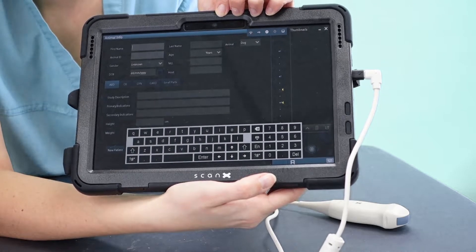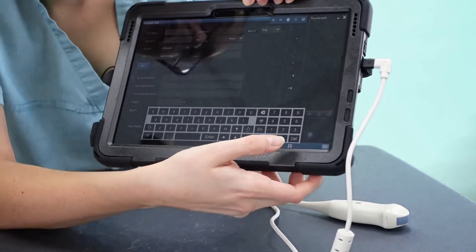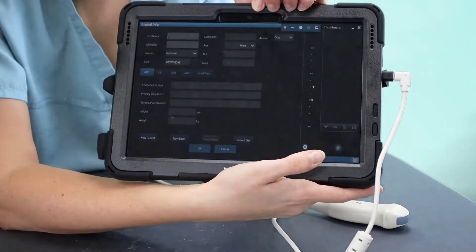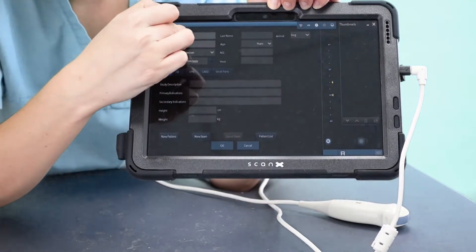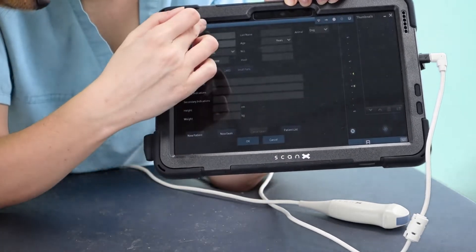I'm not going to put a patient ID in here — I'm just going to put Doppler's name. I'll press the keyboard icon and then when I click into that box I will be able to start typing her name.